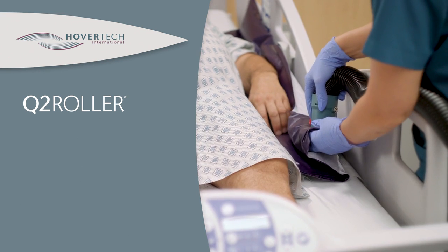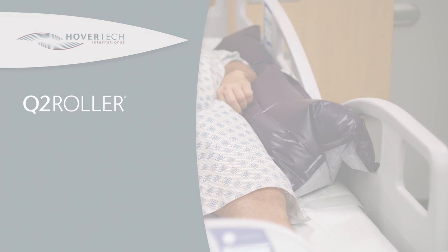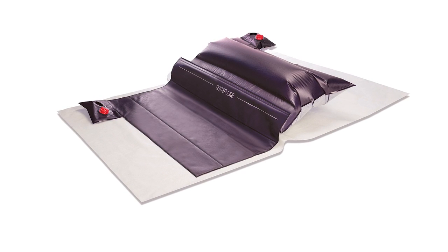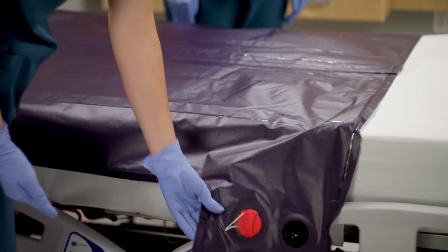In this video we will explain how to safely operate the Q2 Roller Lateral Turning Device. The Q2 Roller has two inflatable chambers, each containing an inflate valve and a red capped quick deflate valve.